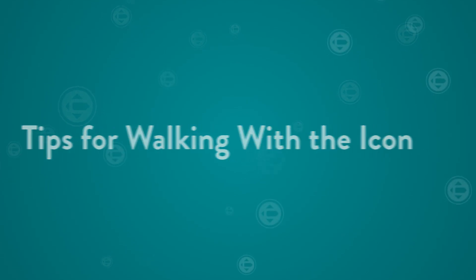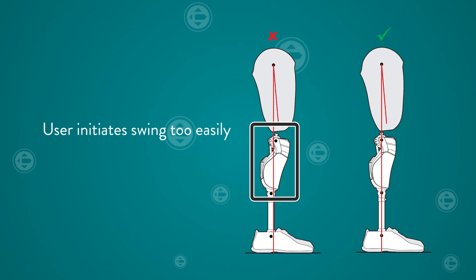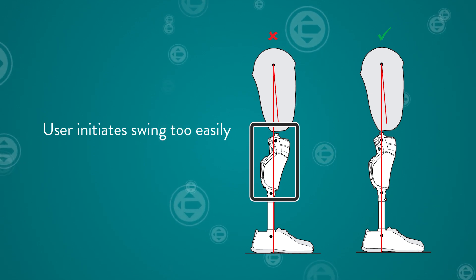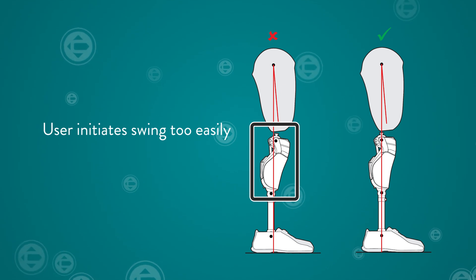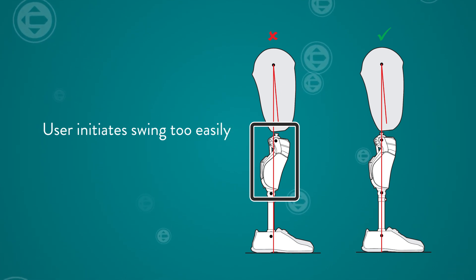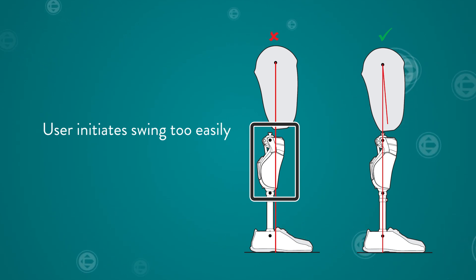Let's look at some examples. If the user initiates swing too easily, check the location of the load line. Ensure the knee is vertical at mid stance. It should not be tilting forward, because that means the user is meeting the forward tilt requirement too easily. In this case, the load line is too far anterior and should be moved more posterior.